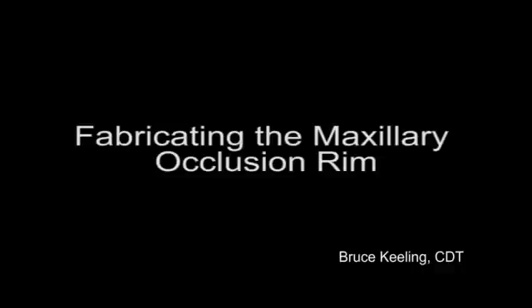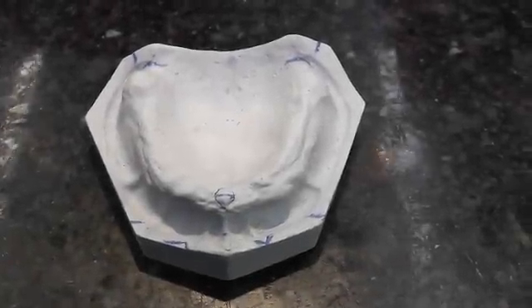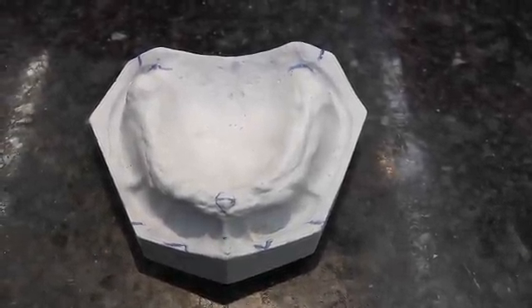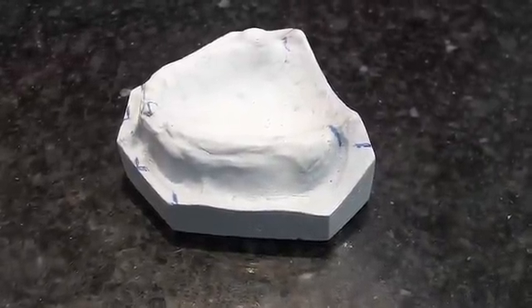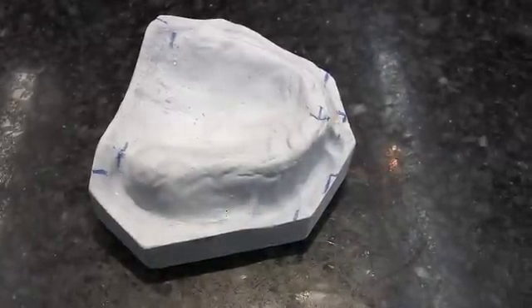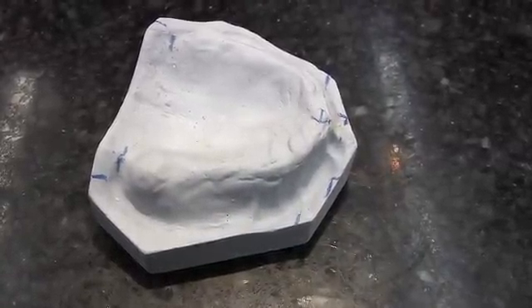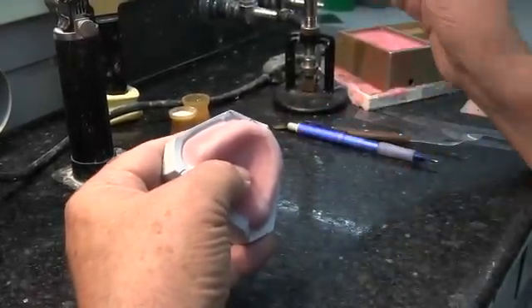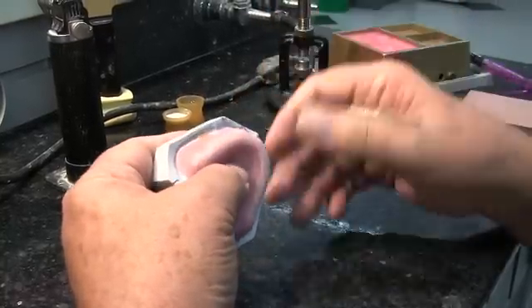Welcome to this video on fabricating the maxillary occlusion rim. On our master cast, we have landmarks marked: the center of the residual ridges right and left, the incisive papilla marked in the middle, and those lines extended out onto the land areas. We also have a mark six millimeters anterior to the middle of the incisive papilla, which will help us with our wax placement later on.